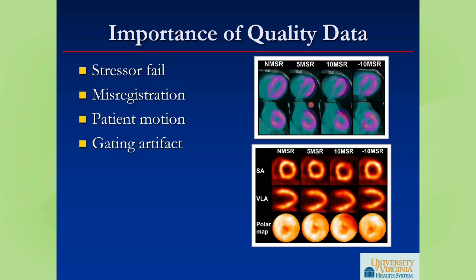You can see the dark line here where the PET image is hanging out over the lung field, and it's even more prominent here. And you can see that also here in the coronal view. And what that results in when you look at the perfusion images is a prominent anterolateral perfusion defect that is not at all due to abnormal perfusion. It's due to misregistration.